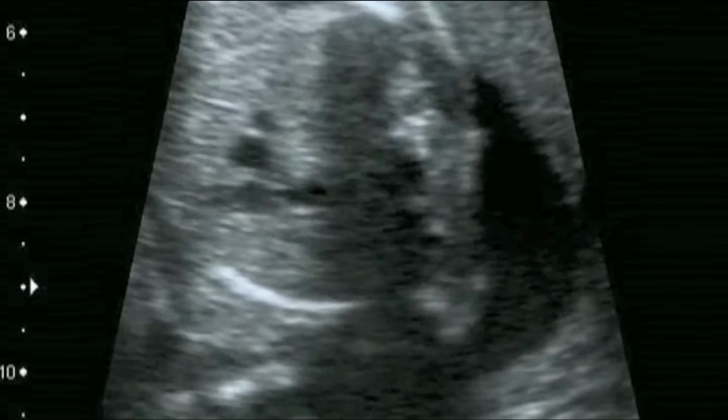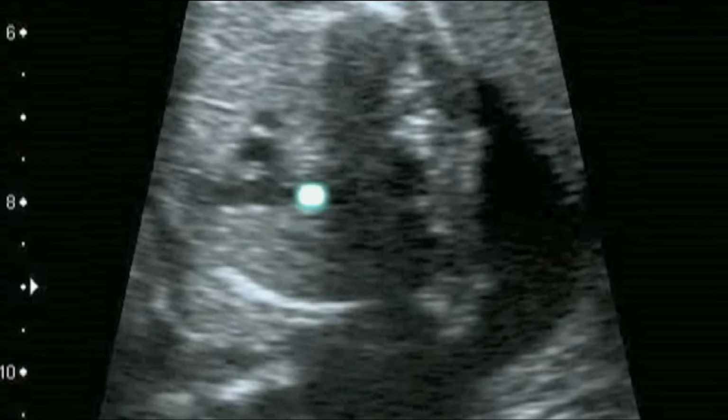Pulmonary valve running into pulmonary outflow and then on into the ductus arteriosus. Ascending aorta. Superior vena cava.